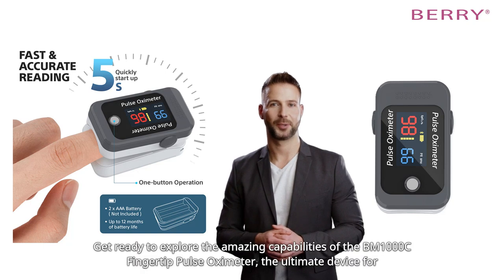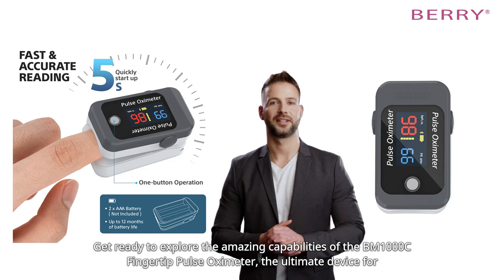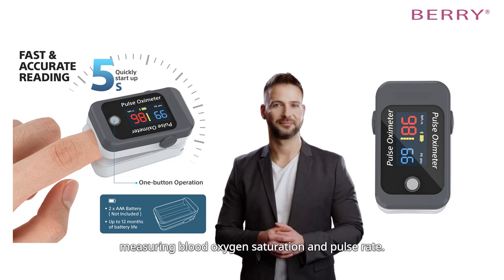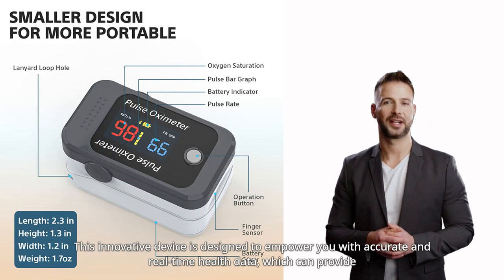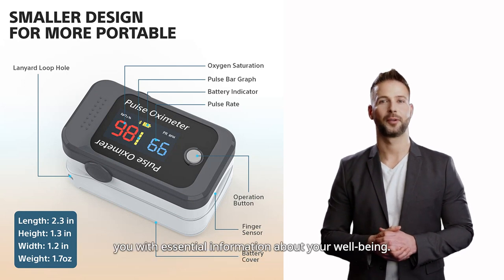Get ready to explore the amazing capabilities of the BM-1000C Fingertip Pulse Oximeter, the ultimate device for measuring blood oxygen saturation and pulse rate. This innovative device is designed to empower you with accurate and real-time health data, which can provide you with essential information about your well-being.